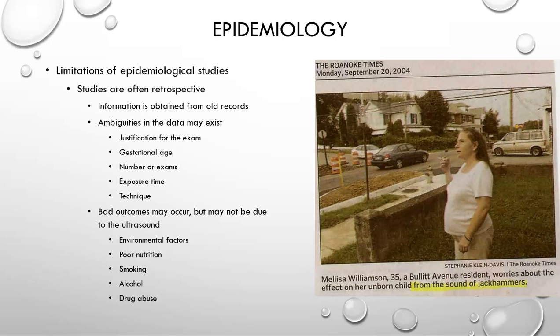Bad outcomes may occur, but may not be due to the ultrasound. So if we see a problem with babies being born, it could also be environmental factors, poor nutrition, smoking, alcohol abuse, drug abuse, or perhaps it's the sound of jackhammers.